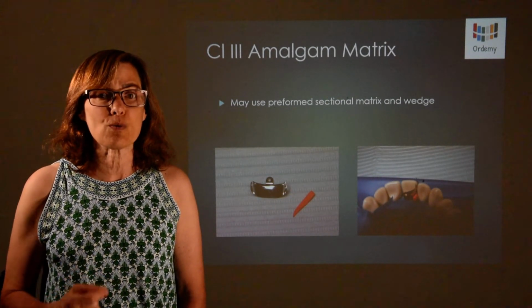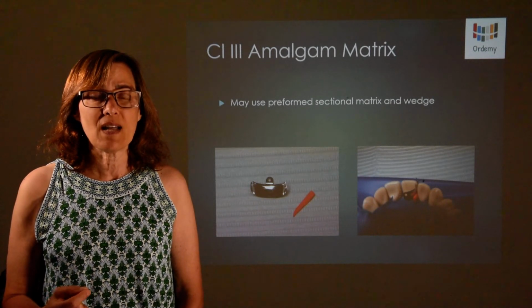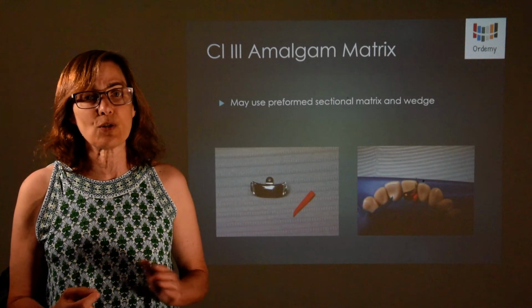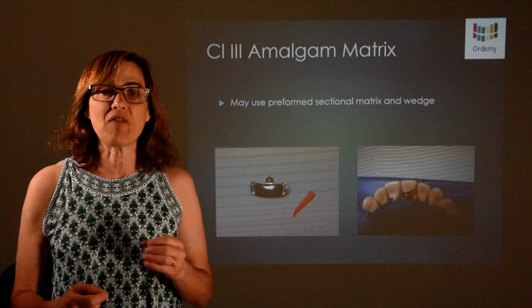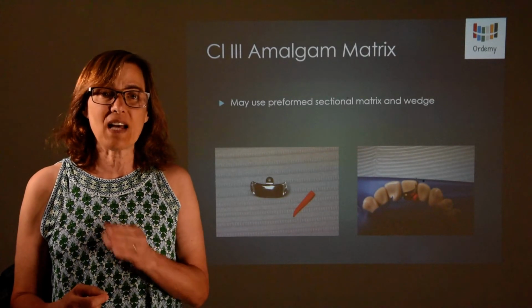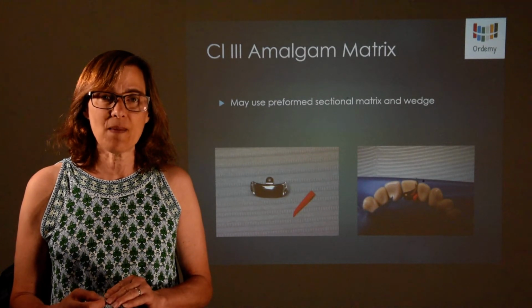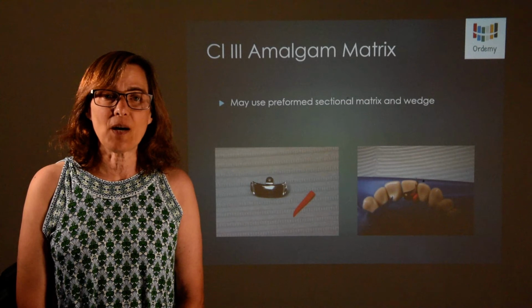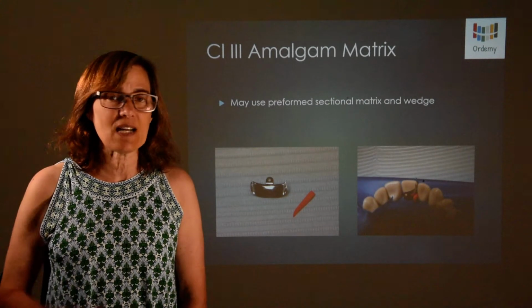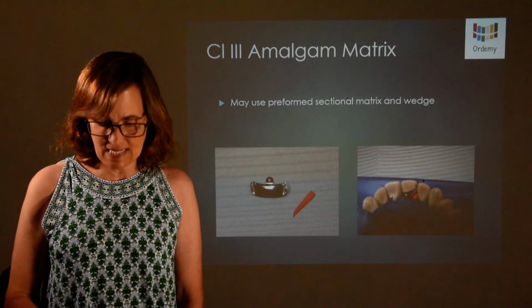If you choose too small a wedge, there is going to be too much material, and instead of following the contour, you will have more of a bulbous shape at the gingival margin, and that is going to cause the patient to have gum irritation in that area constantly.